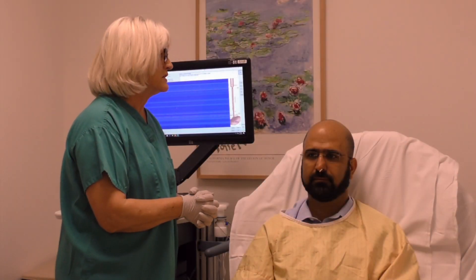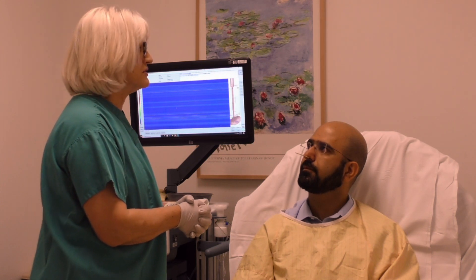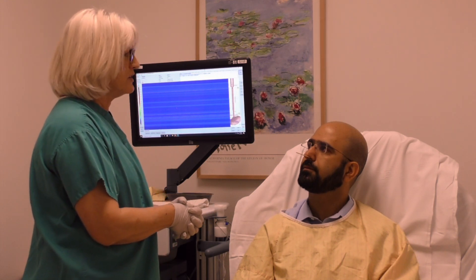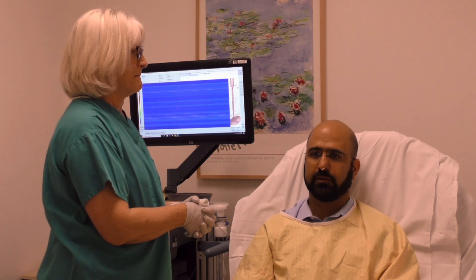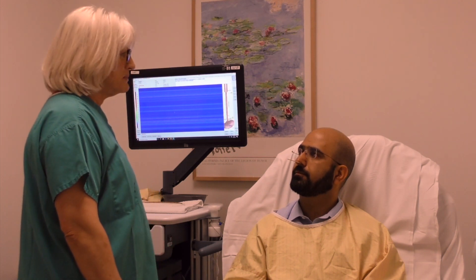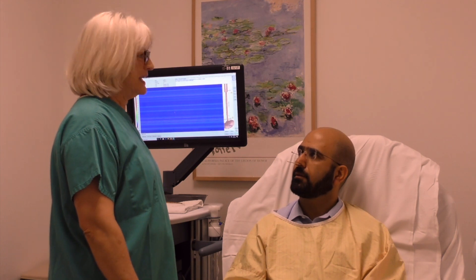Dr. Kishishot will be doing the procedure today. She will put the manometry catheter into your numb nostril and then ask you to swallow water. Swallowing water will help the manometry catheter go into the esophagus. I will be here to guide you throughout the procedure. When the catheter is in the right place, Dr. Kishishot will ask you not to swallow for 30 seconds.